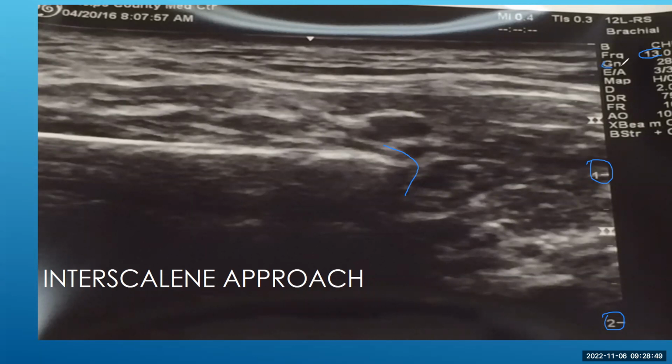Again, this is just my preference. The gain is at 28, so don't judge me too hard on that. You're like, this image is terrible, it's too dark. I hear it all the time. I do a lot of consultant work for various regional anesthesia companies, and when I go to various hospitals in the US, a lot of people criticize that the image is too dark. You can lighten it up with the gain if you want. But I think, one, we can appreciate all the anatomical area, and we can see our needle just fine with that type of gain. But again, each to their own preference.